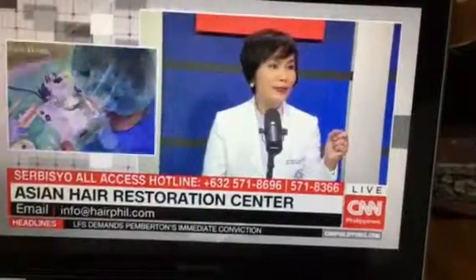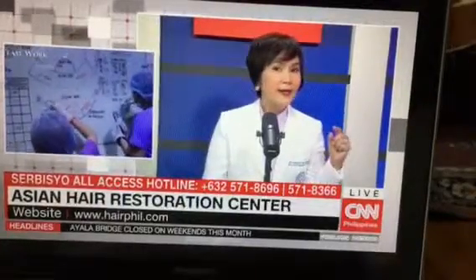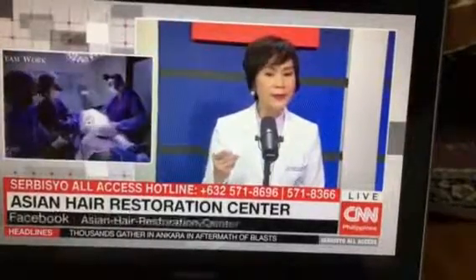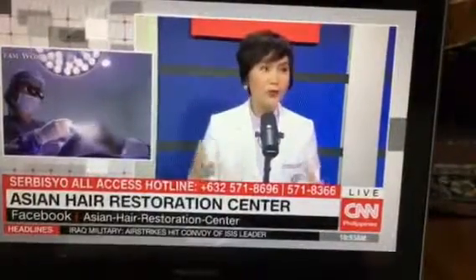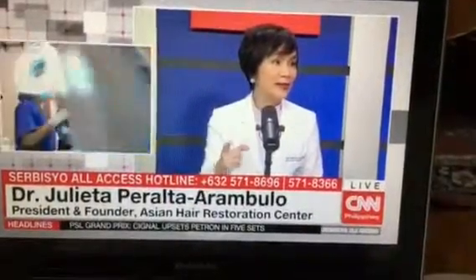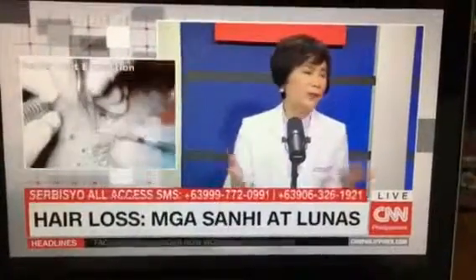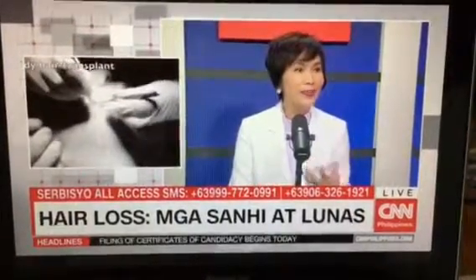And then of course, in my experience kasi, it's just one instrument to do that procedure. In my experience kasi, I have 3 ways to do the extraction of the follicles. Kasi sometimes the machine is not working, and then nakahiga na yung pasyente. We have to do it the other ways. No, I use different kinds of instruments, from the simple disposable needle to a much smaller machine with a handpiece and a punch, and another machine which is disposable. So you just have to be ready pag nag-malfunction yung isang instrument. And robot is just one machine.